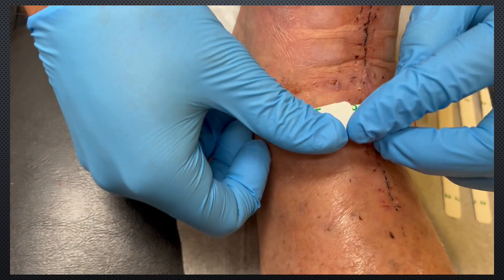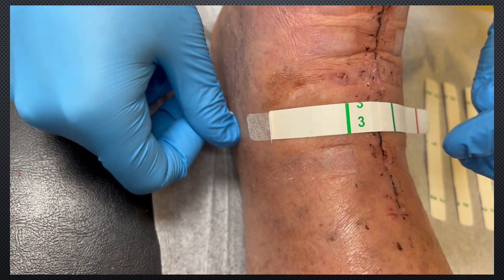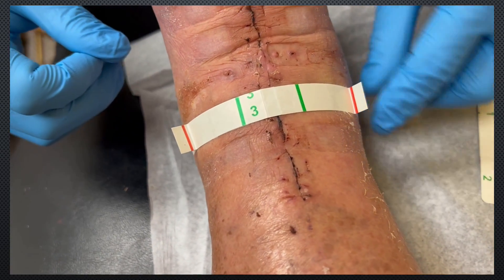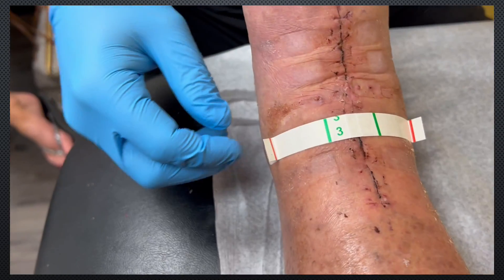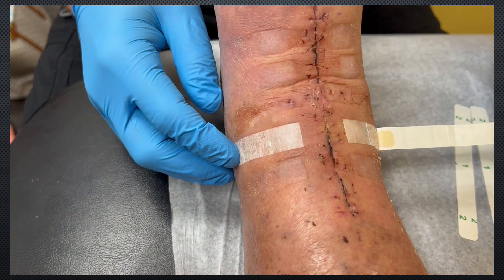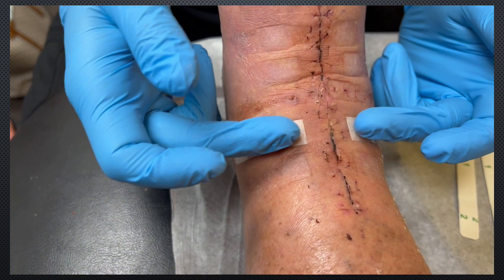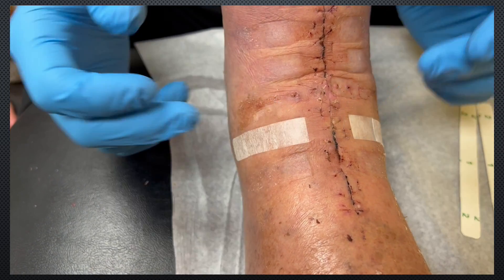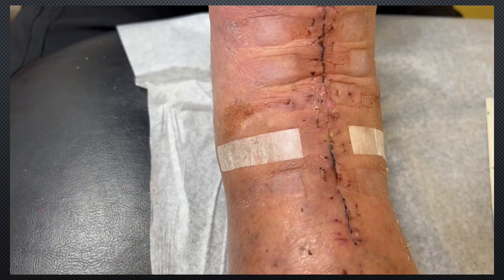Then number 2, you just roll off down that way. Roll off down here, and then take number 3 off. And there you go. You've got Steri-Strips on both sides with some elastic in the middle, just alleviating some of the tension off of that incision.